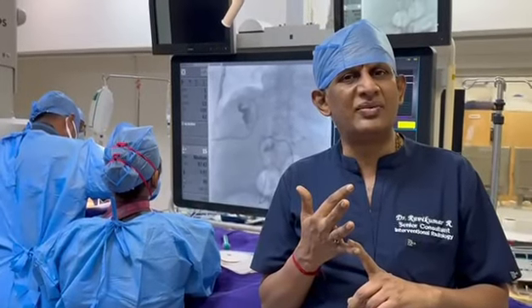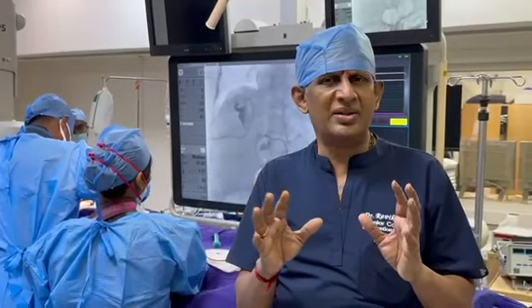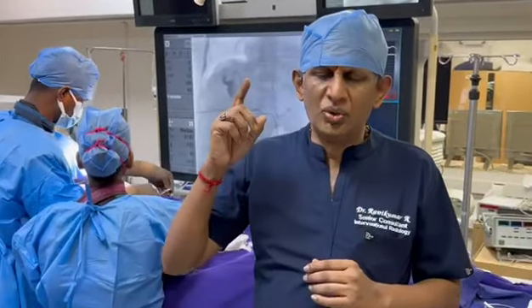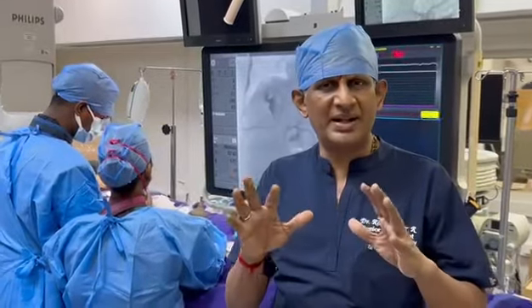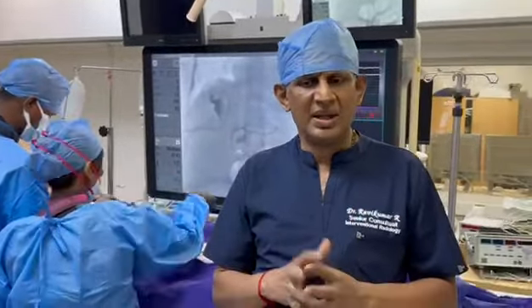Look into the parameters like PT, INR, and looking for any infective source. So once you've decided that these are the points, and then you've studied the MRCP quite in detail, the person who's going to do the ultrasound, make it mandatory that you need to do the ultrasound, because you can do the punctures under ultrasound guidance or blindly under fluoroscopic guidance. So once you have decided and planned, discuss with your seniors. This is what the plan is.